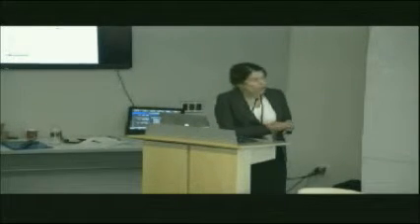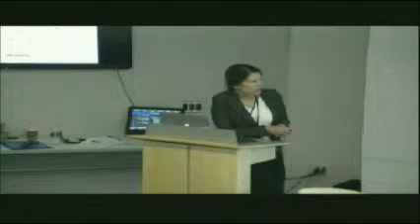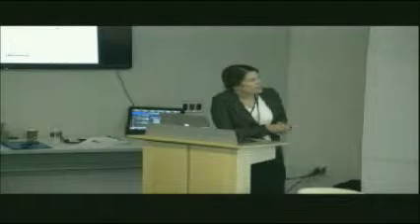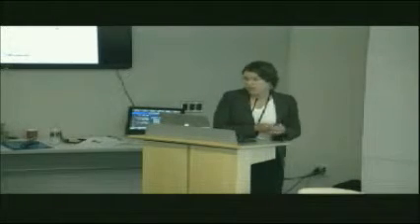There's also something called a recruitment curve. So that's important to me because I want to know when I stimulate with TMS, here I'm doing it at 100% and then increasing up to 150, what that MEP amplitude does. And if I build a curve like this, I can get more information about what the entire network excitability is like. So that's another measure that I use a lot.